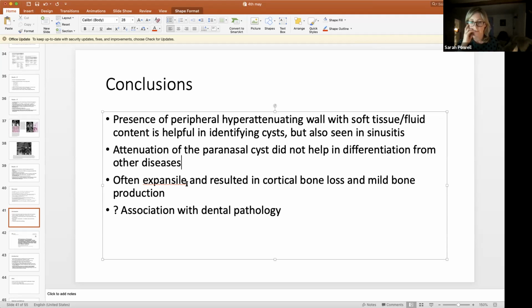And certainly without the benefit of the power injector, when I'm doing them standing, it's very variable, the speed at which the contrast goes in and what time the horse actually then gets scanned after the contrast has gone in, because you've got to get everybody out, you've got to make sure the horse is in the right position, and then you've got to press go. So I thought that was interesting. Yeah.